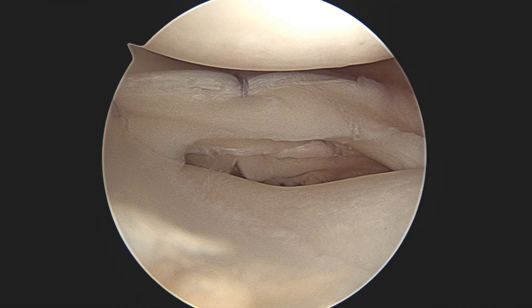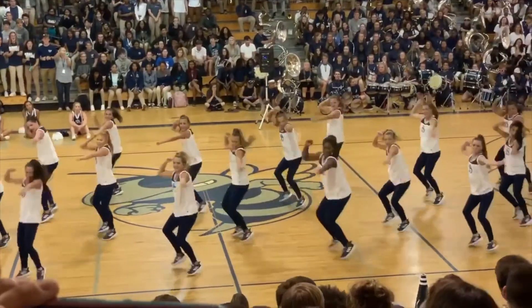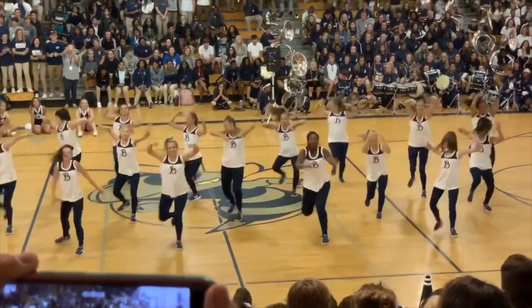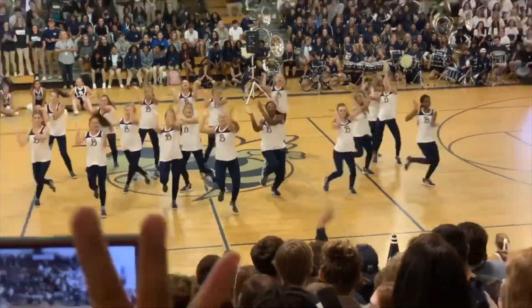Here you see our final construct. Here's our patient back in action — front row center — doing what she loves best after a successful meniscal repair.